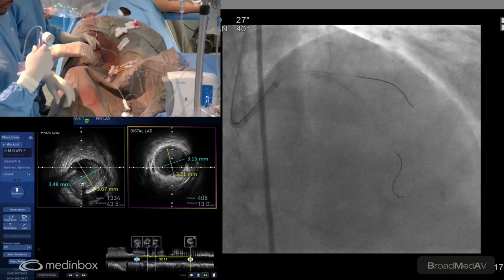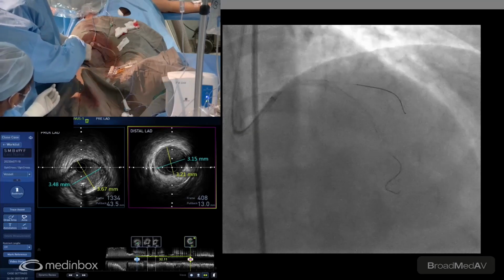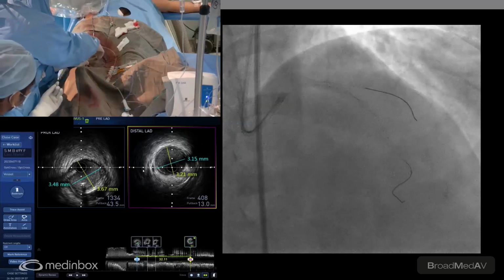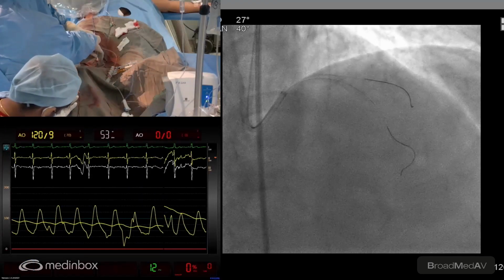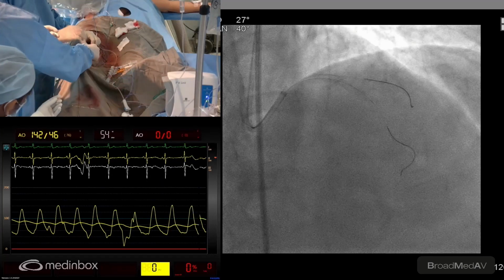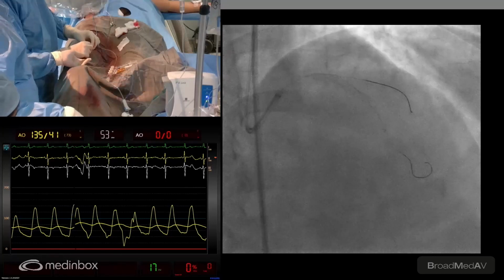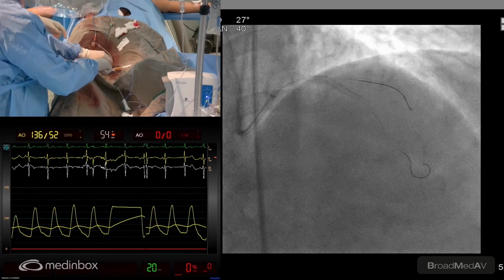Get that stent balloon out. So distal LAD averages are about 3.1. If you notice, 3.15 and 3.2. Either we can take a 3.0 or 3.25, go a little high pressure distally. That's good. Go ahead.